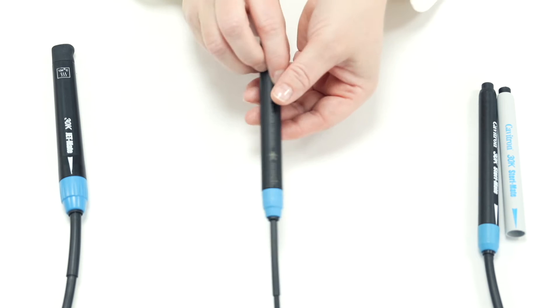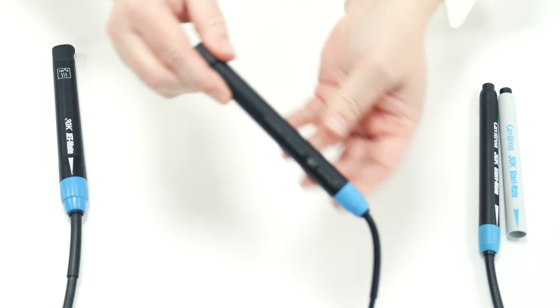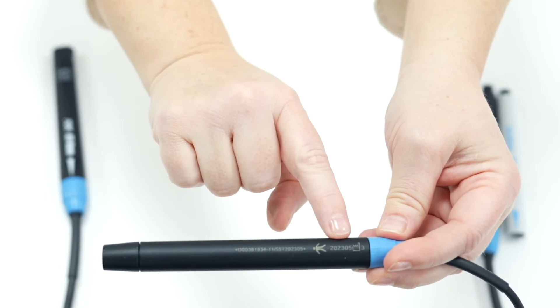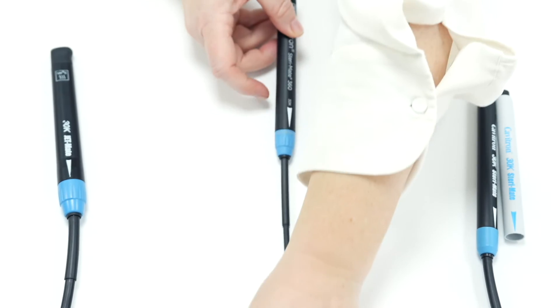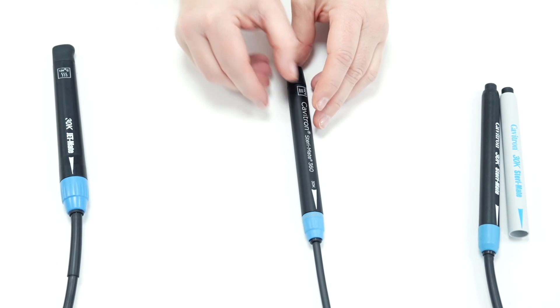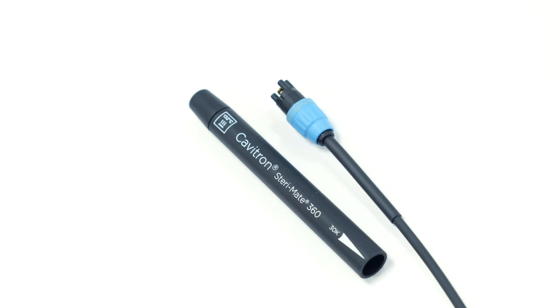It is therefore worthwhile to open any new Stereomate to make sure it is working perfectly. If the product does have an initial fault it will be within the 6 month warranty period and will be replaced by Dentsply Sirona. Dentsply Sirona does not over-manufacture products — they manufacture to order, which means any Stereomate or Cabotron insert you purchase will have been manufactured within a couple of months of the purchase date in most cases.